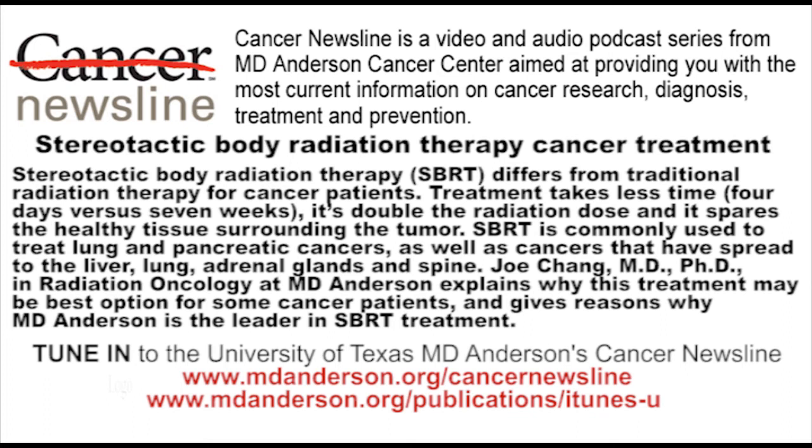Your typical patient for SBRT is early-stage lung cancer, and typically lung cancer is not caught at the early stage, but things are changing in that respect, aren't they? Right. As you know, the NCI-supported research project for lung screening found that with spiral CT screening in high-risk patients, screening actively can reduce lung cancer-related deaths by 20%. So currently, one unique part about our program is we can integrate into the management of patients who underwent the lung screening program and were found to have lung cancer, and then they can do either surgical resection if they can tolerate it, or they can do SBRT.